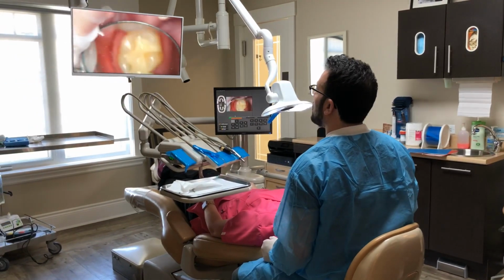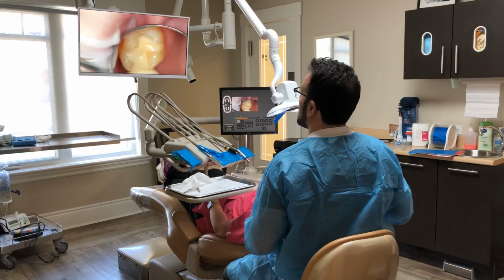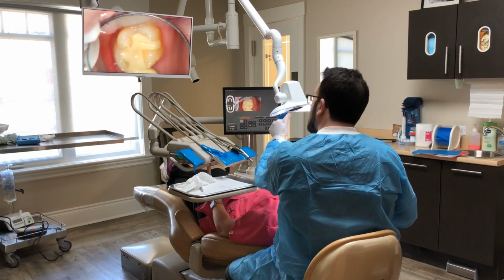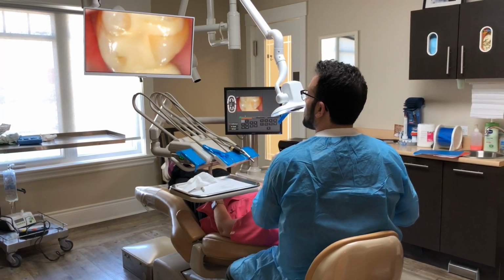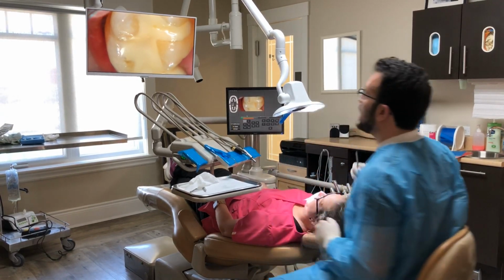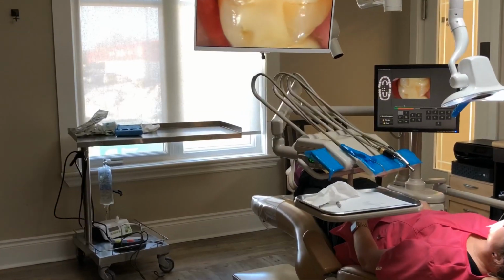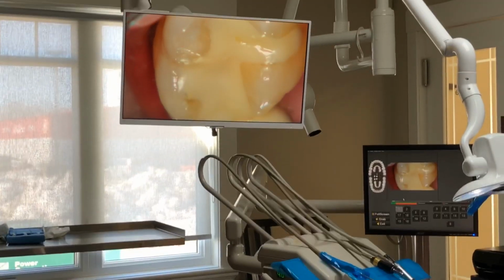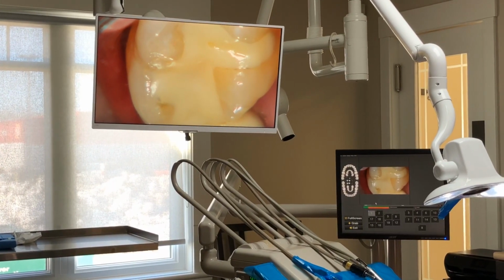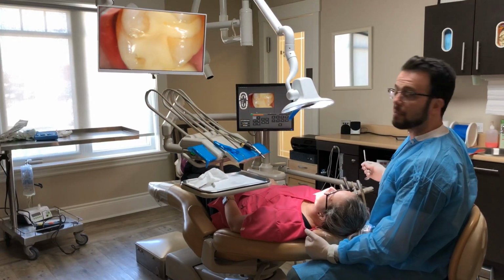So for endo, as you've seen on some of the videos, let's go to a higher zoom. So take a look. So this would be an equivalent of about 50x. So you can see the image. Most of the time, previous to the ELIO with my Zeiss scope, I don't work at this magnification unless I'm doing something very particular. But you can see the extent of the zoom, and again, you can capture this image.